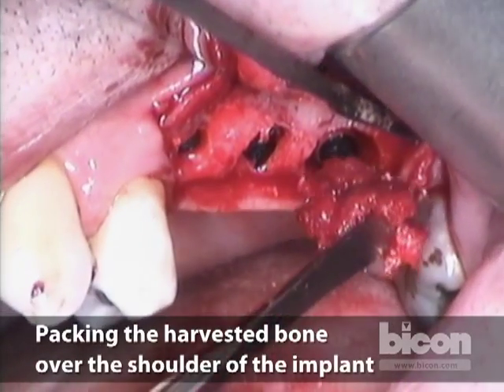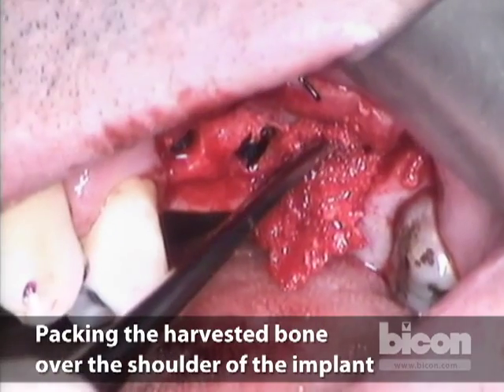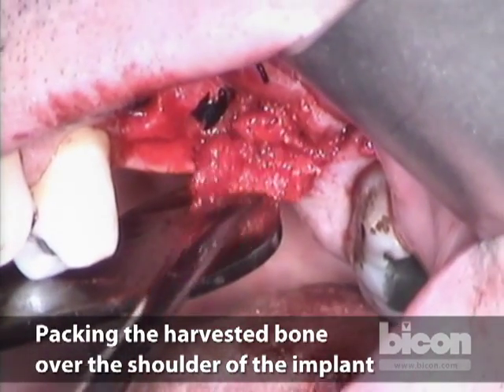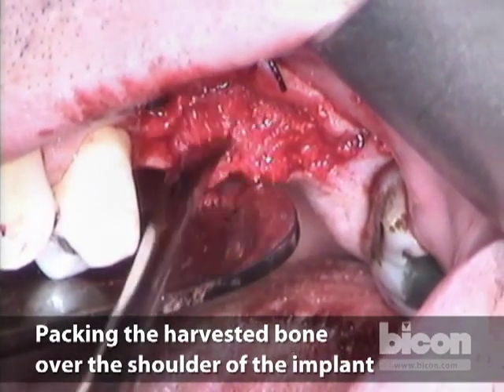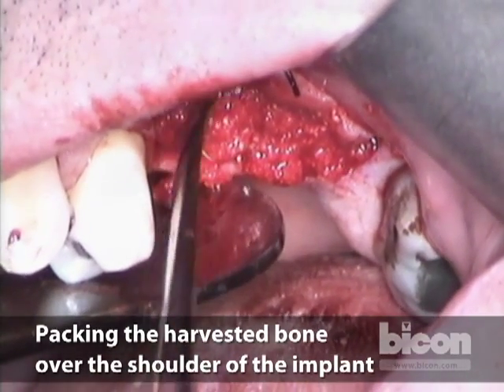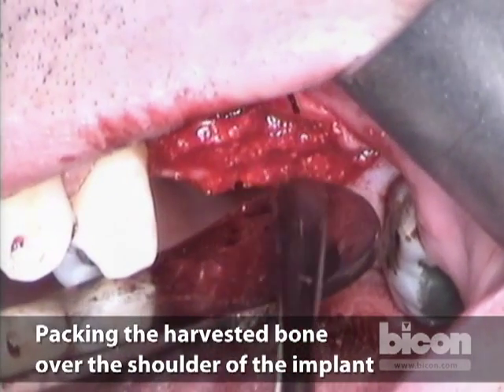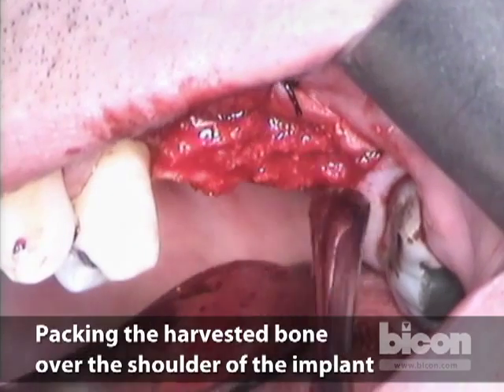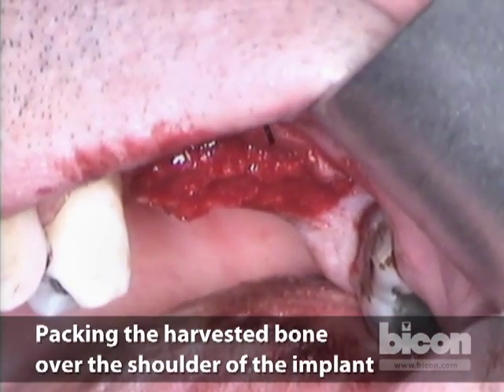Now we will pack the autogenous bone, since we've used practically all of the graft. We'll pack that over the implants. As you see, we now have this really biologically active bone over the shoulder — that's going to create a favorable environment for the shoulder to receive new bone.